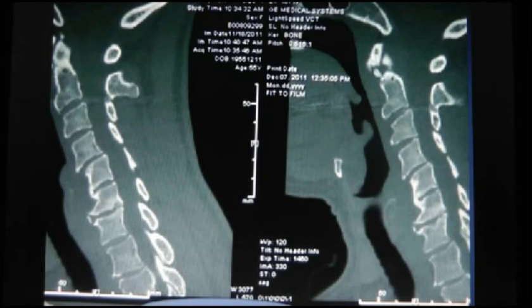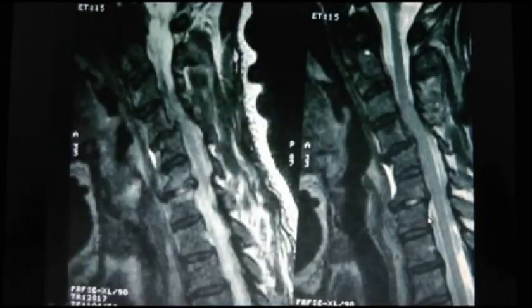Does the CAT scan tell you anything? Other than, as she's supine on the CAT scan with her head back, it reduced a little bit. It's not looking as bad, right? Yeah. How about C5-6? Is this interesting? What is this anterior fusion of osteophytes? Fused. A little bit odd. C6-7 fused? It's not fused, but look at the stenosis at C6-7 and C5-6.